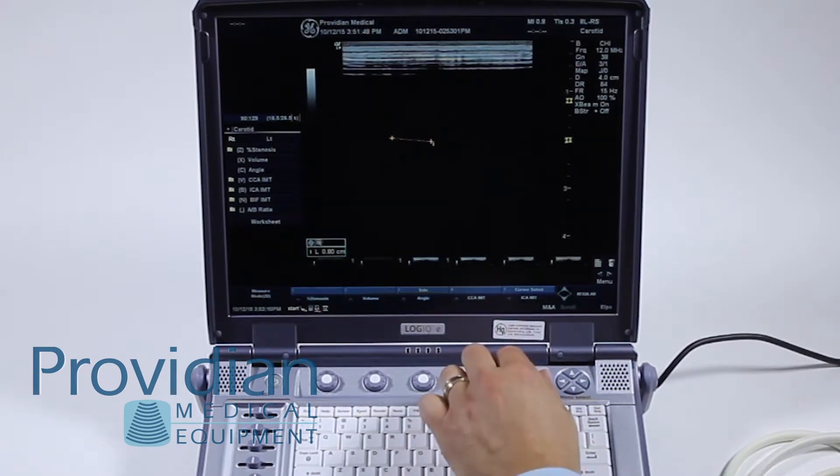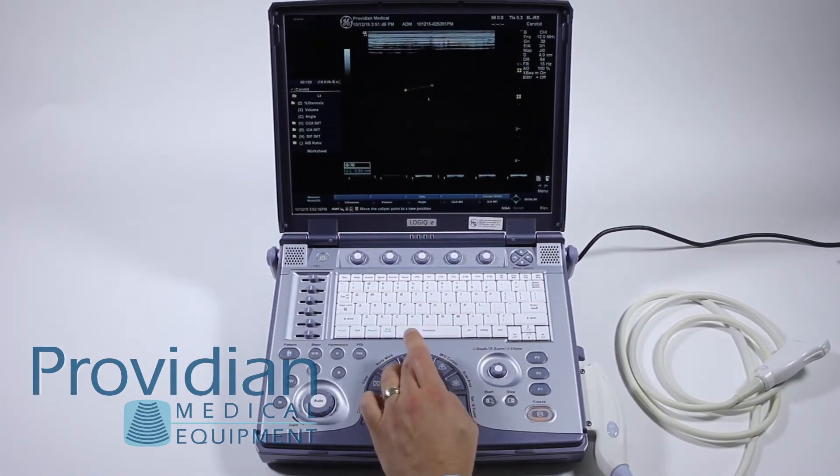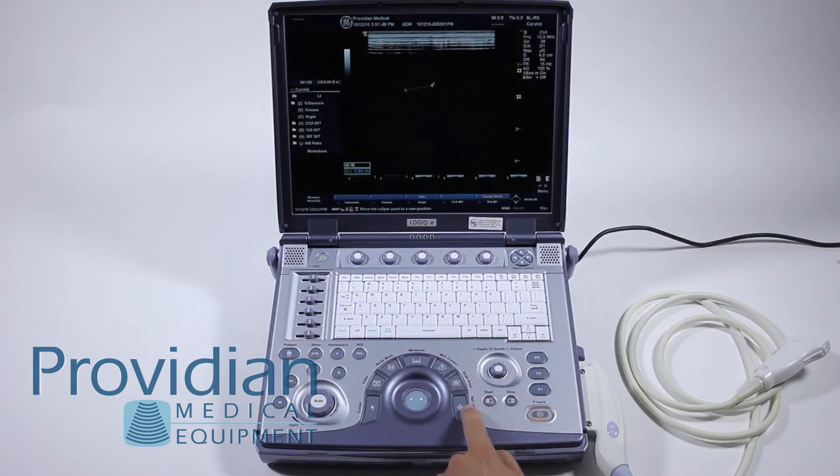If you want to go back and change that measurement again, you can twist the cursor select and it will reactivate that caliper. Then hit measure to go back and forth between the measurements, hit set, and it saves that measurement.